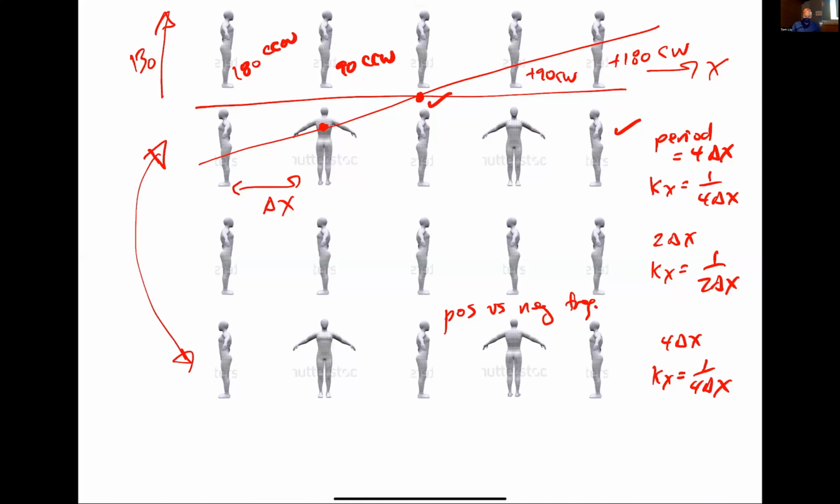Okay. And then the last thing is we do one more step, at least in this example, then it'll end up here. So now what is the spatial period here? It's 1, right? But in this case, is there any spatial variation at all? So where will we say that this is in terms of kx? What frequency is this? 0, right? So this is what we mean by 0 frequency. So really there's no period to talk about, right? The period is sort of undefined because there's no spatial variation.